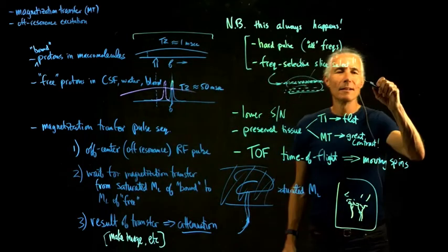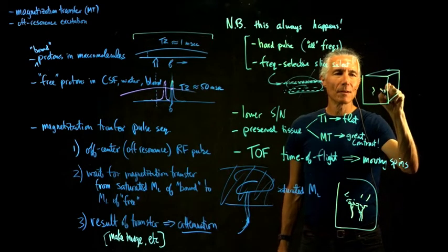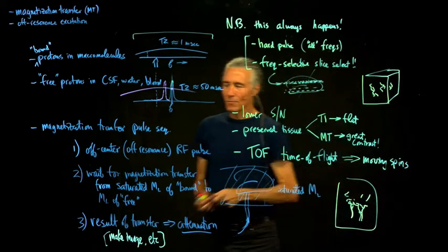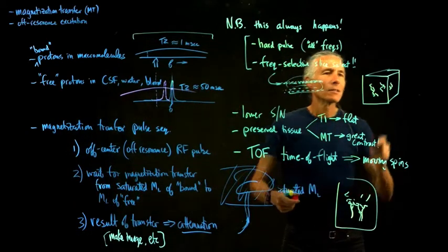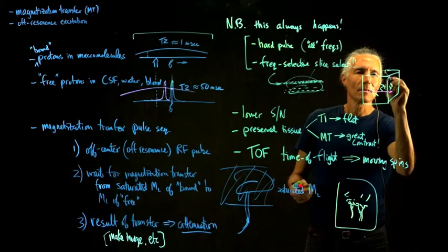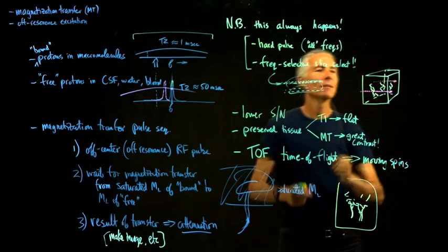So if you take a block of voxels, and those voxels have some blood vessels in them, say, here like this, some bright blood vessels. Rather than trying to actually reconstruct the blood vessels, a simpler thing is just make lines that go through the image. So here's the back of the cube. Just make lines that go through the image. Here's one that comes out here.